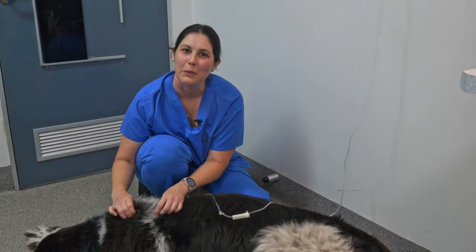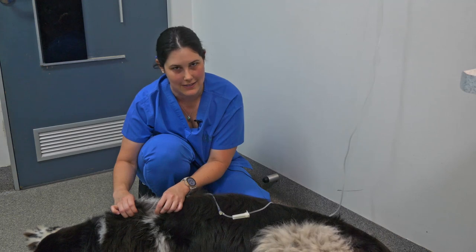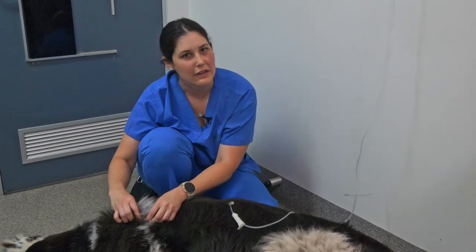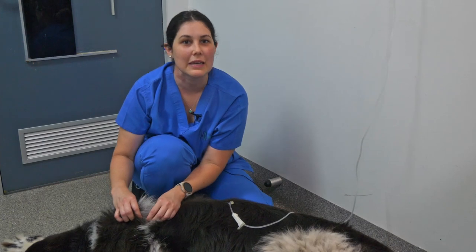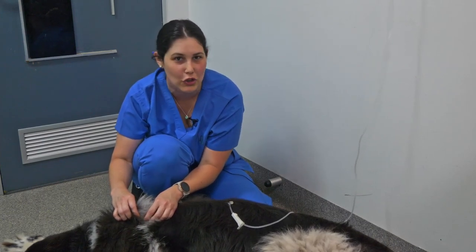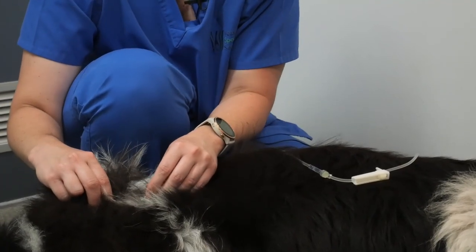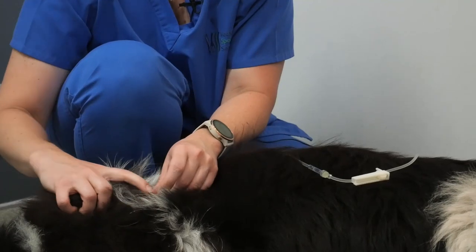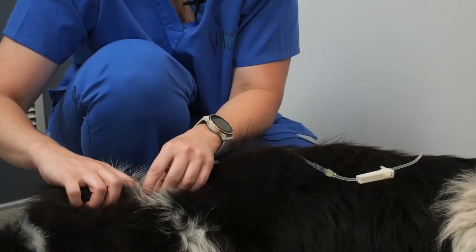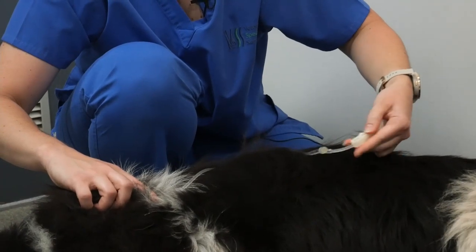Your vet will let you know approximately how much fluid to give into your pet's subcutaneous space. If your pet is not comfortable with the fluids being given, it may be helpful to have a second person distracting them at the front — giving them a treat or maybe a pat. Once you've given the appropriate amount of fluids, holding the needle securely, roll back down that ball and turn the fluids off.